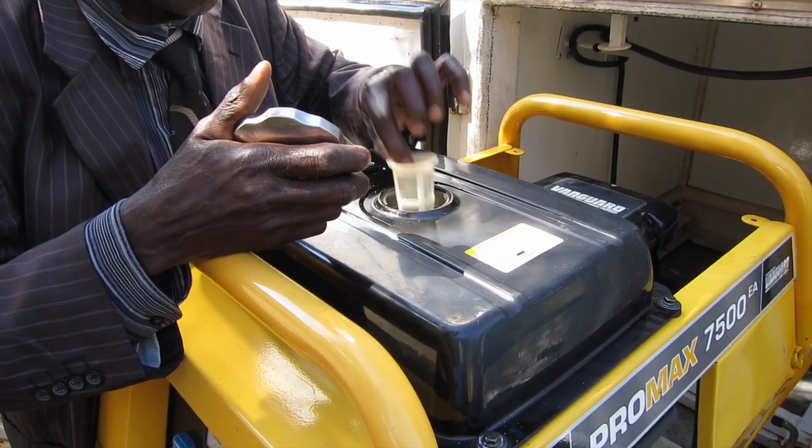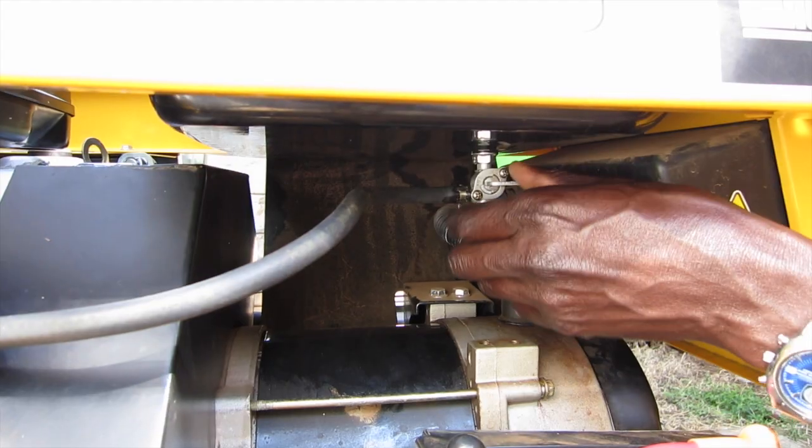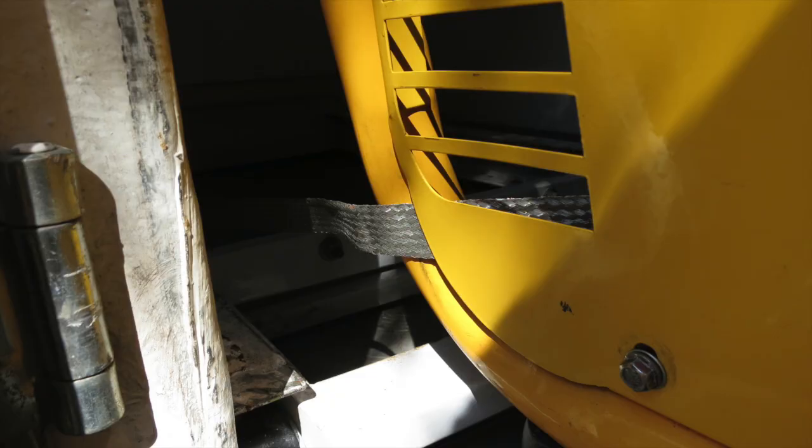Next, check the fuel level in the generator. Return the cap to its place and then turn on the fuel switch, which is underneath the left side of the generator. Also check the grounding strap to make sure it's intact.